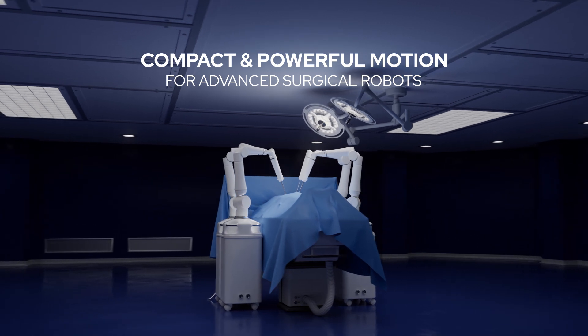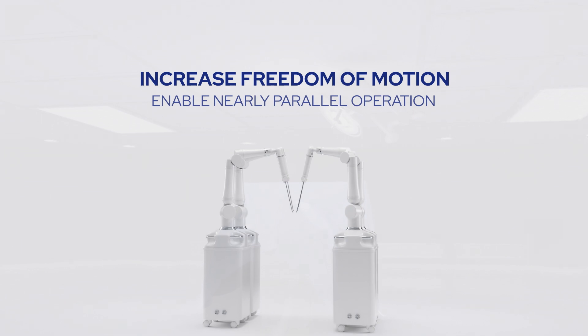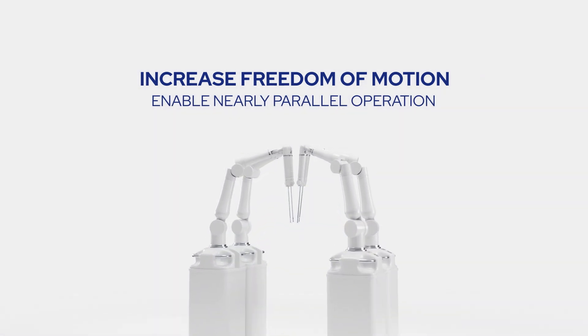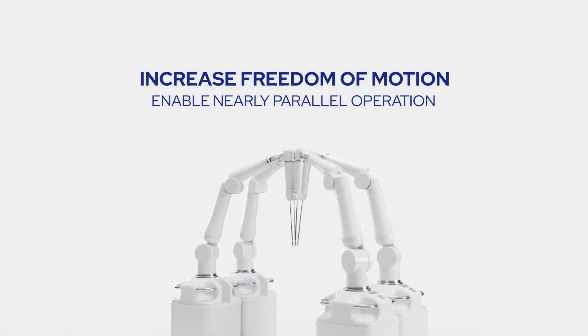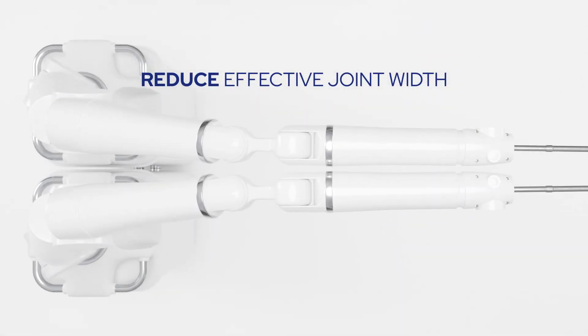How can you design a more capable surgical robot? Surgeons want greater freedom of motion, including the ability to operate multiple instruments as closely together as possible. For robotic arms to approach the site nearly in parallel, you need to reduce the effective width of the arm joints.